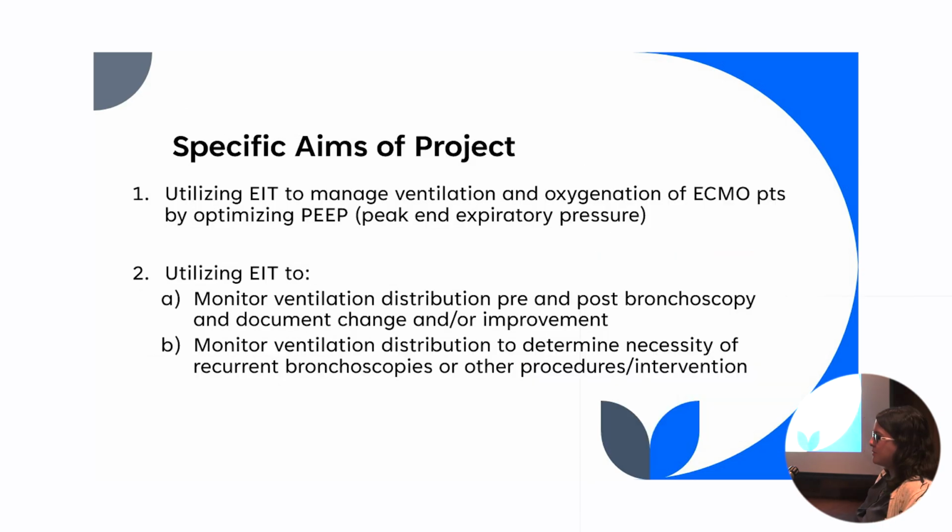So the specific aims of our project: we were utilizing EIT to manage ventilation and oxygenation of ECMO patients by optimizing PEEP. We were also using it to manage and monitor ventilation distribution pre and post bronchoscopy and document those changes, and then further determine if we would need recurrent bronchoscopies by continuing to monitor the patient's lung ventilation.